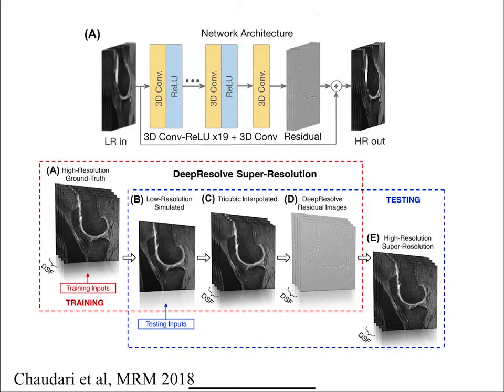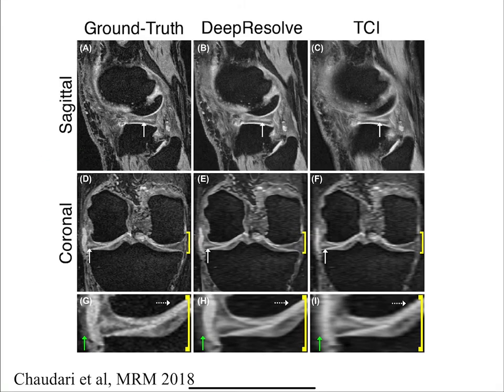So their question was, can we use a deep learning network to get to super resolution and figure out what might have been there? And the idea is, what's between these, because of how images are and how biology works, this has a lot of information about what could happen in here. It's not like anything can happen between these two slices. There's going to be some probability of some things being more likely than others. So they designed the deep learning network to do that.